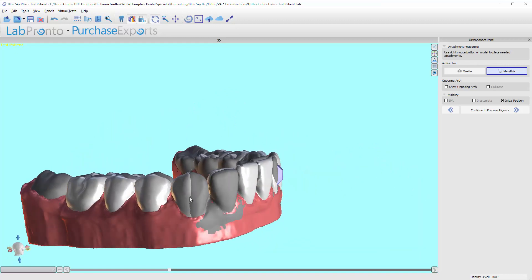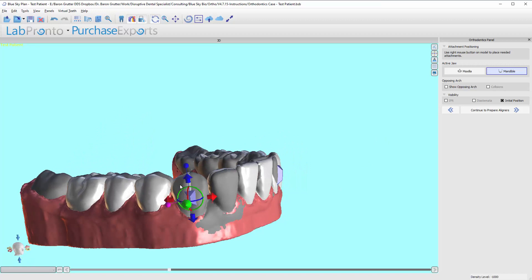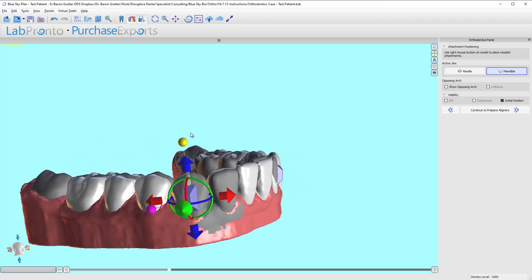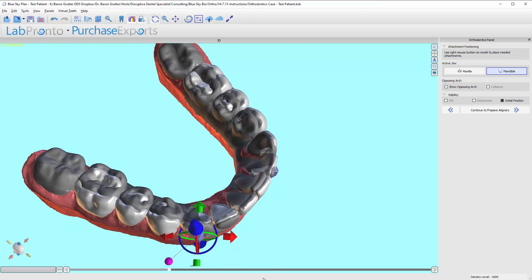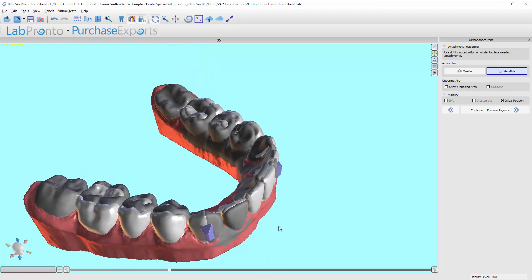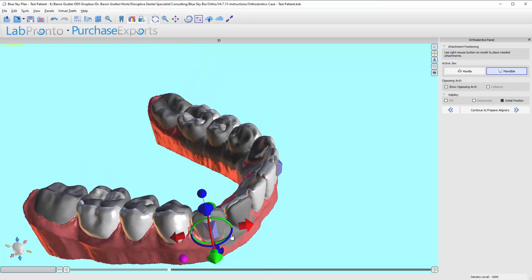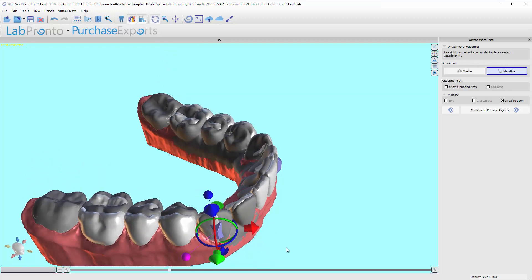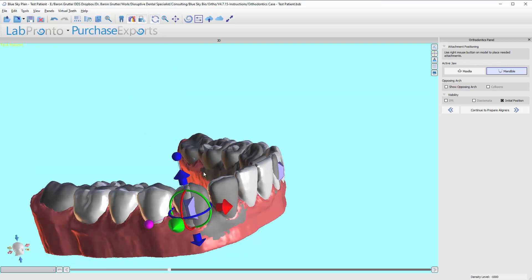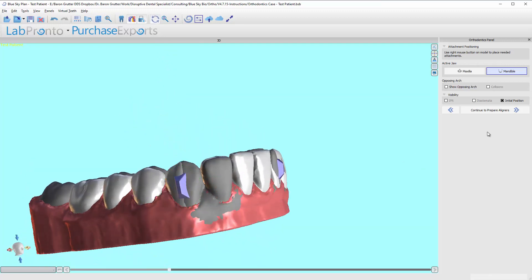And then this one, right click, add previous button. I'll just go ahead and scale it up a bit. Push it in. This time we are, once again, rotating to the mesial, so I'm going to rotate the button to the distal, so I have a little stronger lever arm, and there we go.